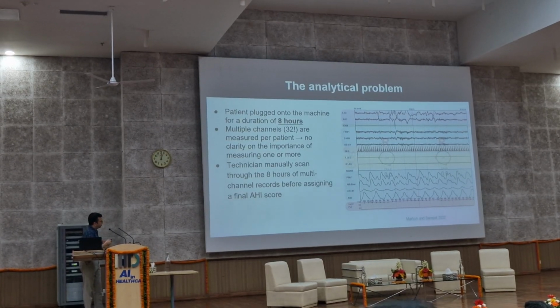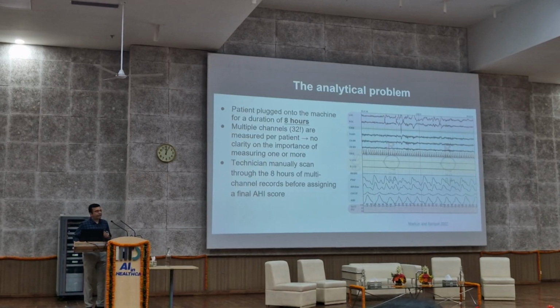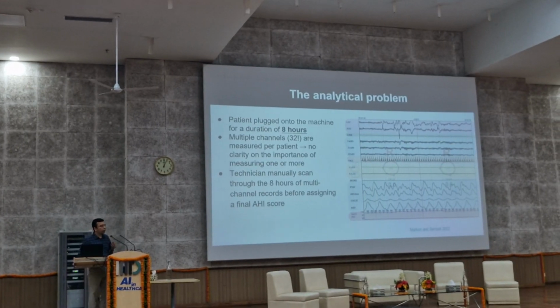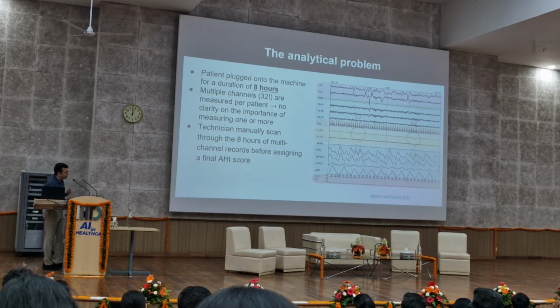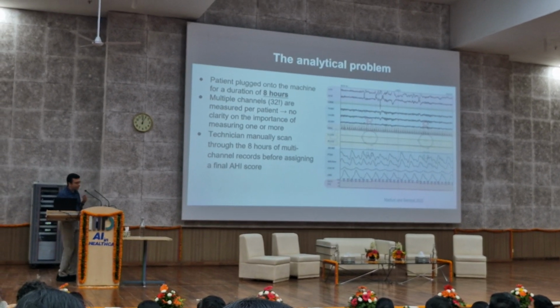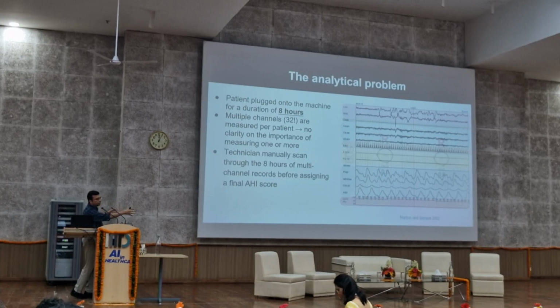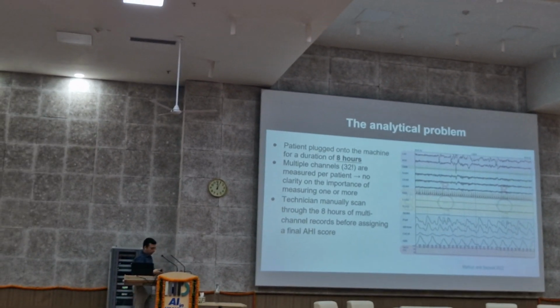So in terms of what the analytical problem is, the technician, once they get this 8-hour scan, the next day they will spend around 4 hours just going through that scan manually and figuring out whether the apnea or hypopnea events the instrument flagged are real or not. And that's where the verification of the AHI index that is generated happens. Now you can imagine that going through an 8-hour scan on a screen will take a long time, and that's why it takes 4 hours.